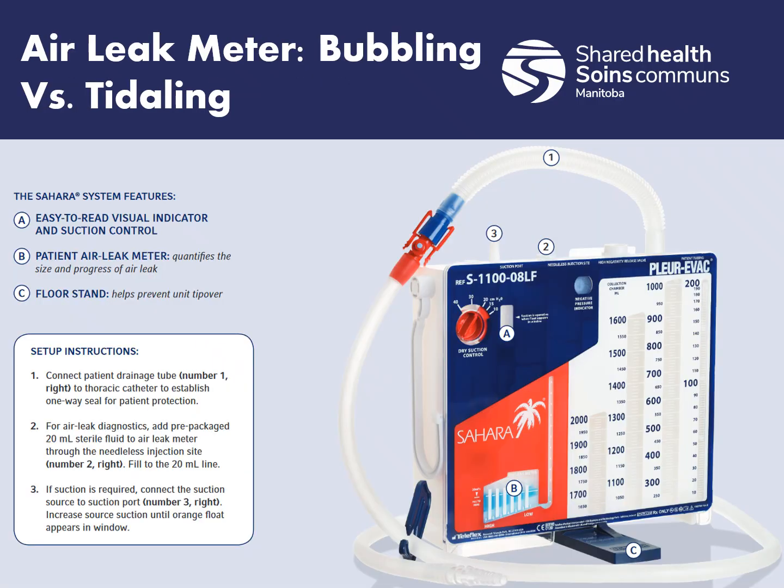So when it comes to the actual monitoring systems, the key thing is to assess for air leaks versus normal air movements, and we'll have to watch the air leak meter. I mentioned this before, this is at the bottom of the device here. This measures air leaks on a scale of 1 to 7. So the higher the number, the greater the air leak. So we want to document this. A little bit of bubbling isn't abnormal, but if there's a lot, we definitely want to monitor our patient and document that that's what happened.